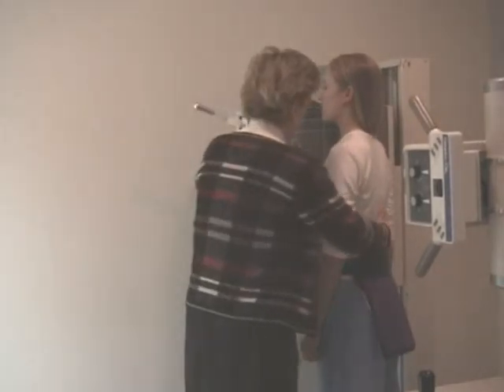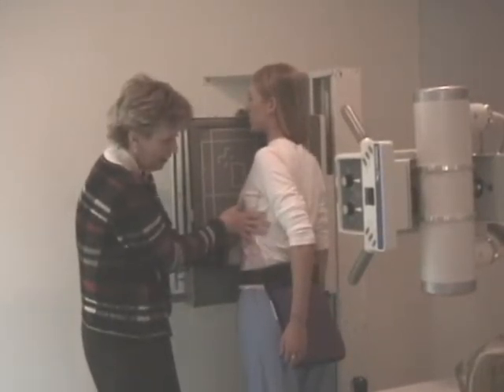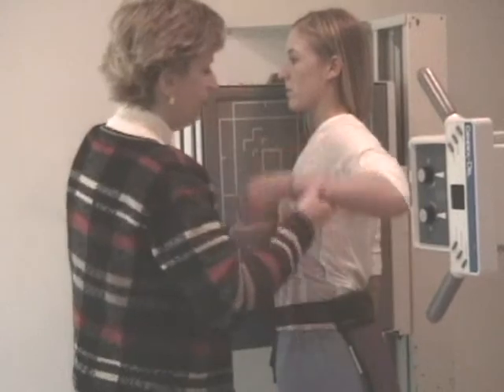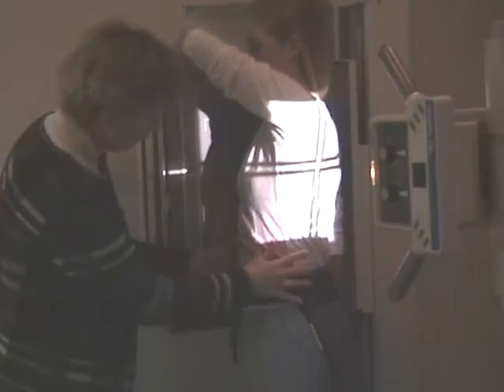But I'm trying to lay out these ribs here. If she was a shallow oblique, see how shallow oblique, my fingers are this way. I've got to oblique her more to where you are going to be more perpendicular to her lateral ribs. This arm would have to come up and out of the way of the ribs. And I'm after the left side, so I'm going to look right down here and only have a baby amount of light on there. I wouldn't do that because I'm giving the doctor no information at all. I'd bring her over here. And then I would have her take in as big a breath as she could, and I would make the exposure.